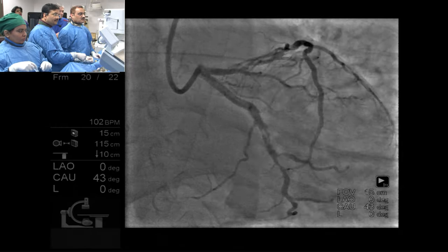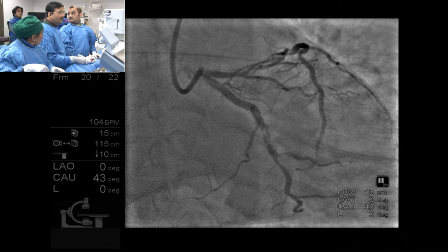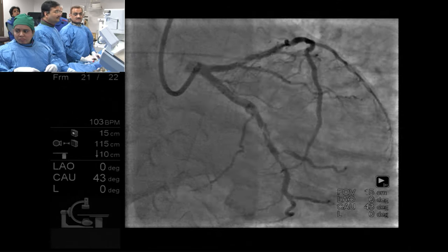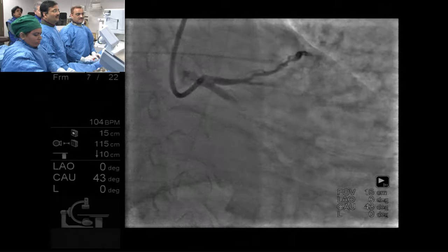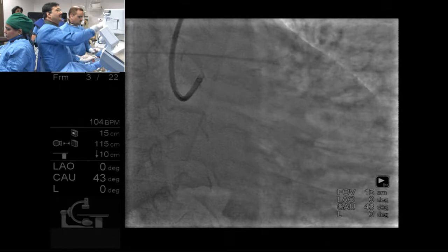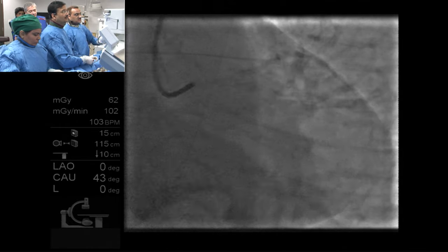Dissection. Wow. That looks a little bit different, so we do not know. Run-through wire, guys. So that's a complex lesion. What's your plan now? First to wire it. What kind of wire? I generally use Run-through if they have it. I think your guide is also rooting very aggressively. Yes. There we go. Okay, fine.